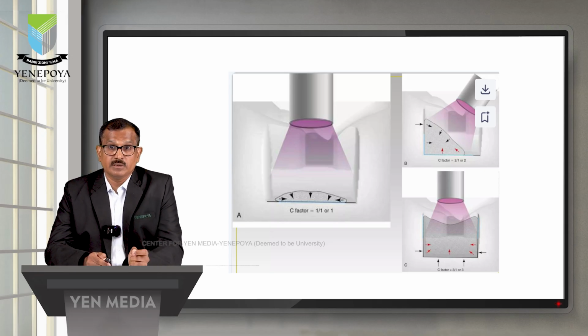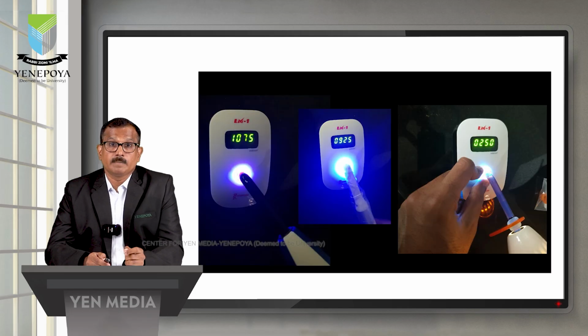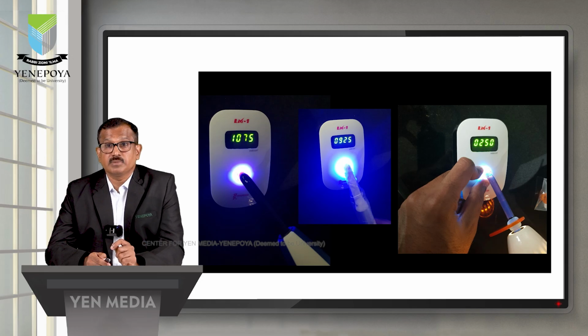So that is very important to understand. Now this is something to explain, because everybody talks about all this restoration, placement, everything, but nobody talks about how important our light cure unit is as well. The light cure unit might give you the light, but see the intensity. This is just an example, because we should always check whether your available light cure unit is giving the maximum output or not.